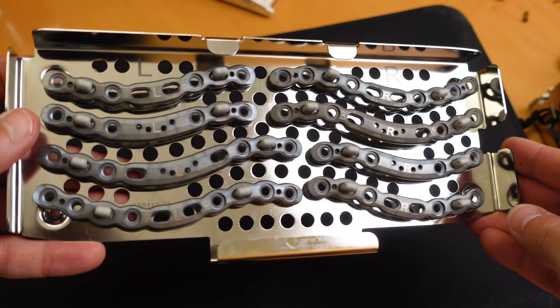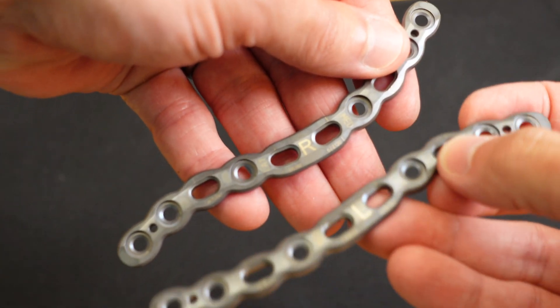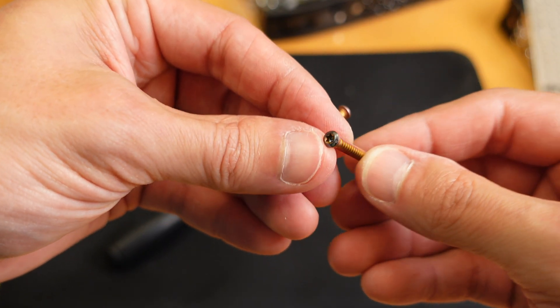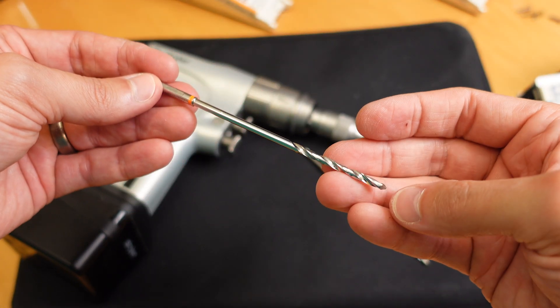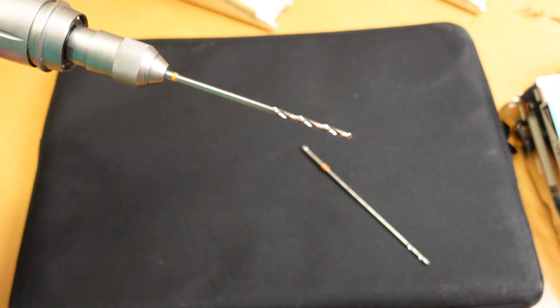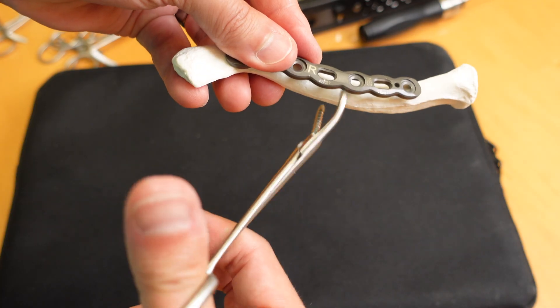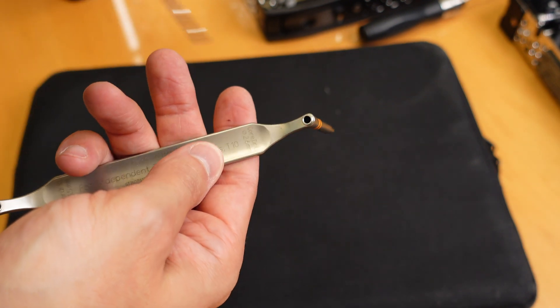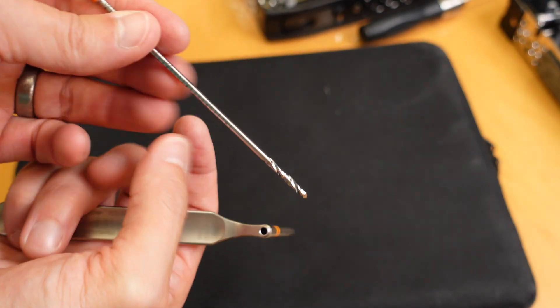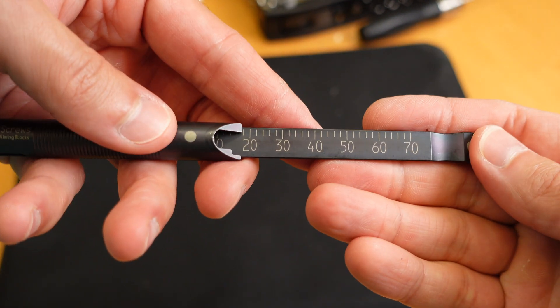These sets include the plates themselves, of various sizes and lengths, and they're actually made for the right and left sides specifically. They also include screws of different sizes and lengths, drill bits of different sizes, clamps which help us reduce the fracture back together and help us secure the plate to bone, drill guides which help us precisely place the drill bit through the plate to the bone, and depth gauges which help us measure for the precise length of the screw.